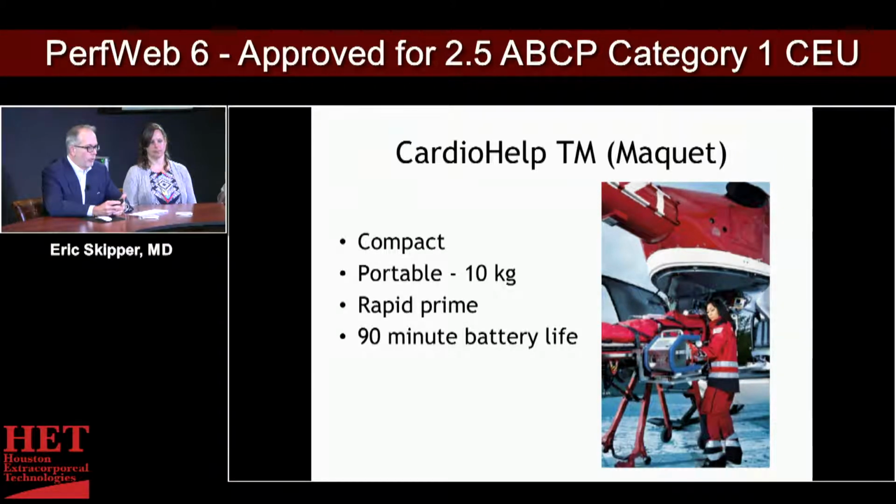It's ideal for transporting patients in a spoke and hub model where patients may be urgently cannulated for a cardiomyopathy or post-cardiotomy failure and need to be transported to a quaternary care center, for someone like myself on the receiving end. Again, the cannulation principles are exactly the same. It's just a way to hook things in.